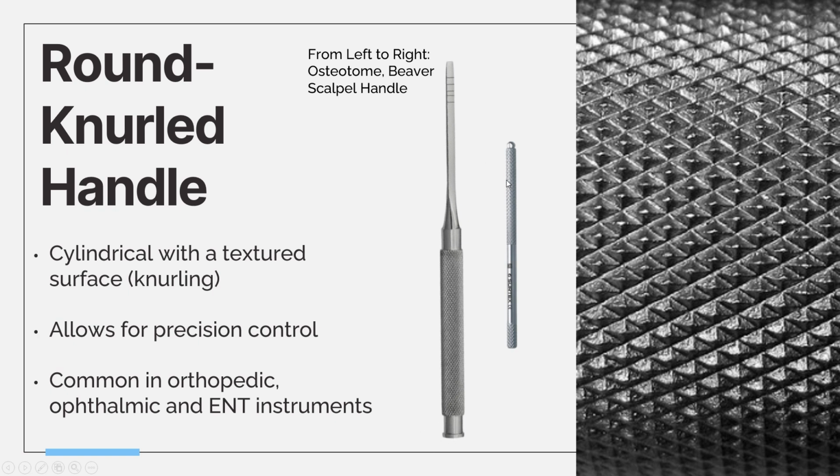And we have a beaver scalpel handle. This is quite tiny for a scalpel handle. For these ones, this tip here can actually be screwed off, and that's how you place the blade. You would place the blade in here and then screw it back in. So when you receive this in decontam, you have to make sure to screw this off and then brush the inside of this just a bit, making sure there's no trapped blood, and then you have to screw it back in together to make sure they don't separate.